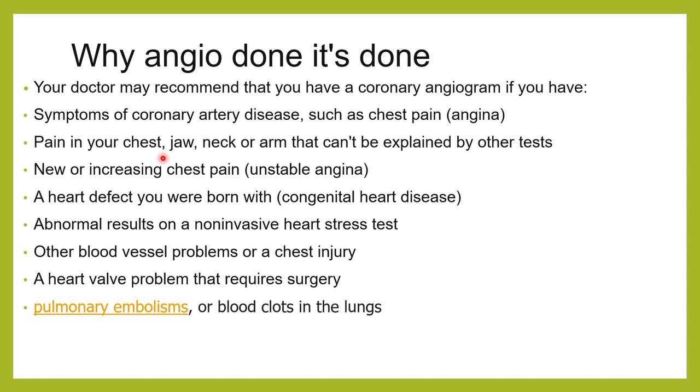Whenever the patient shows such symptoms, the doctor orders an angiogram, because they will suspect there is a blockage in these coronary blood vessels, because of which the heart is not getting enough oxygen. Whenever there is some kind of stress, the patient has exerted or was angry, and the requirement of oxygen became more, but it was not getting it because the coronary arteries could have been narrowed. To suspect and to see if there is a narrowing, we do what is called an angiogram.